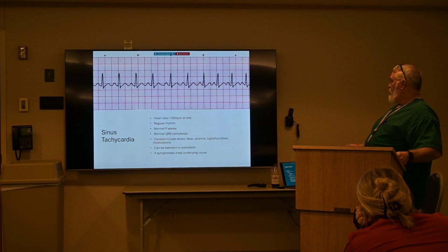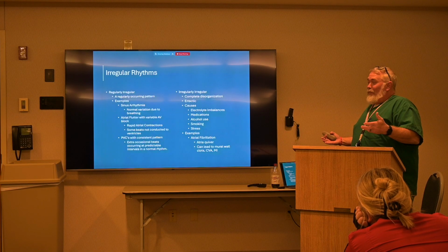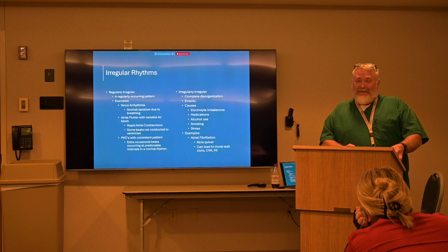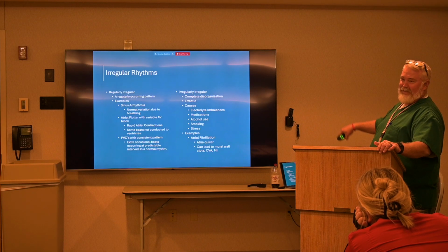So, I assume when you're in school you talked about regular irregularities and irregular irregularities. Do you remember talking about that in school? My nursing instructors, they just harped on us on this.